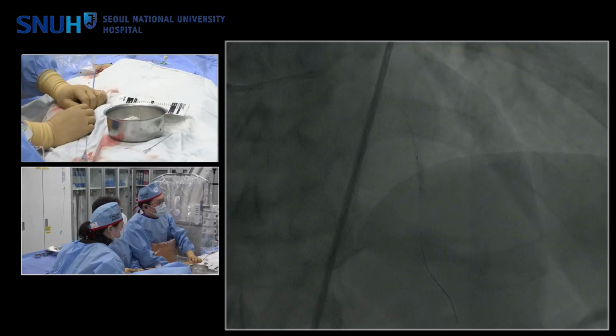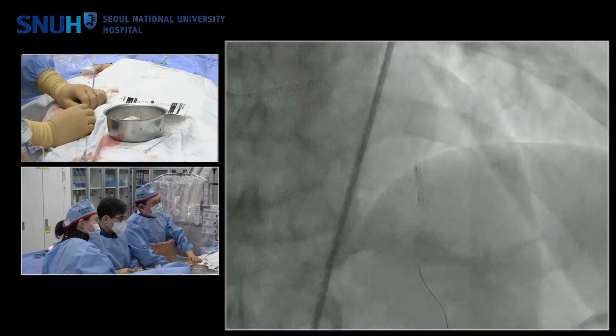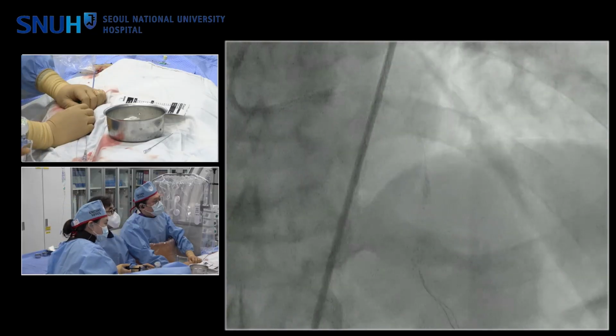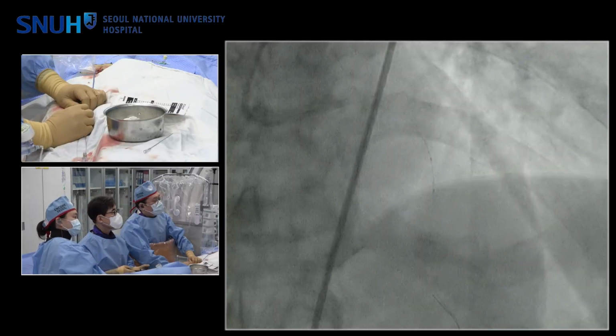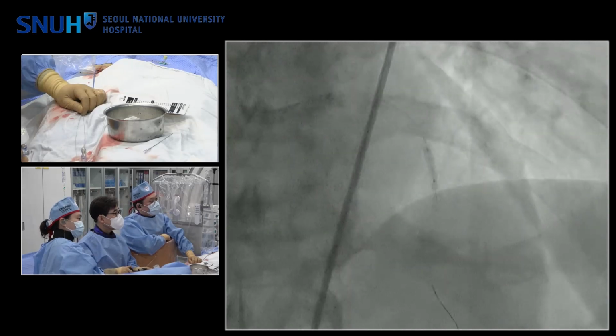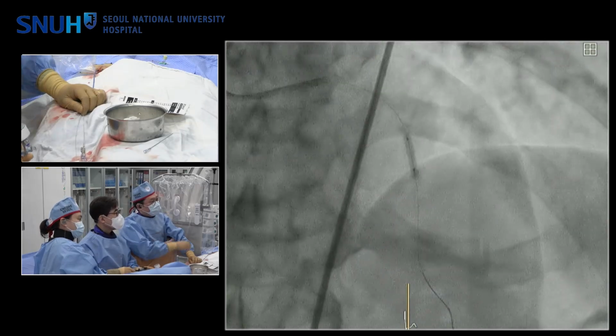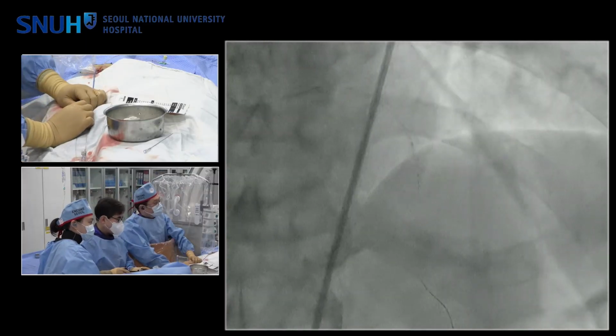Professor Han, this is Cha from Korea University Anam Hospital. You're now doing the NC balloon. Could you consider OCT first before the NC balloon? Because we already did the shock wave, so we can see the OCT image more directly for the effect. How about it? This is the NC balloon.